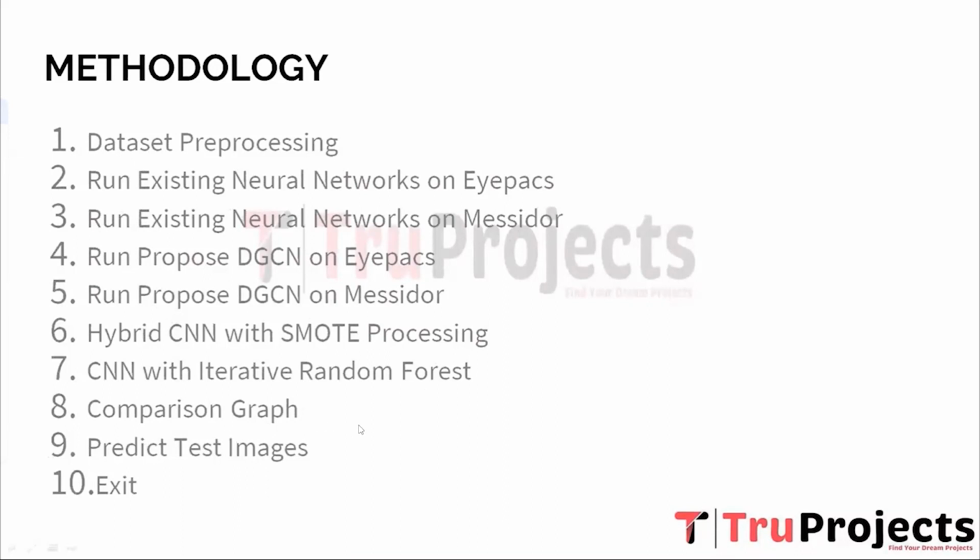Eighth, comparison graph. This step involves creating visual graphs or charts to compare the performance of different models or approaches. It could include metrics like accuracy, precision, recall or F1 score. Ninth, predict test images. After training models, this step involves using the trained models to make predictions on a set of test images. The output could be classifications, probabilities or other relevant predictions.